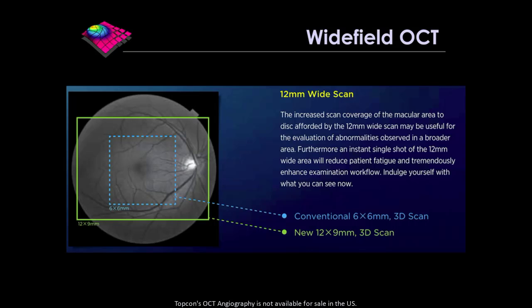So it's pretty quick. And of course, that means that now we get the optic nerve head and we get the vascular arcades as standard in our scans. And it's easy because that's every patient that's being done. So you can have a standard protocol in place. You don't have to have a situation where you're sending the patient back out to the photographer for other scans or a more bespoke system, because the reality is in my clinics in Moorfields, if I have 60 patients on a Friday morning, I'm not going to be able to start messing around with very specialized imaging in all of those patients, except in odd cases where there's a very, very good reason for it.